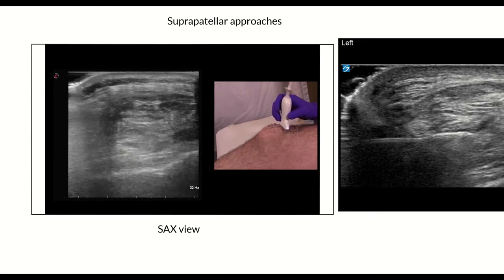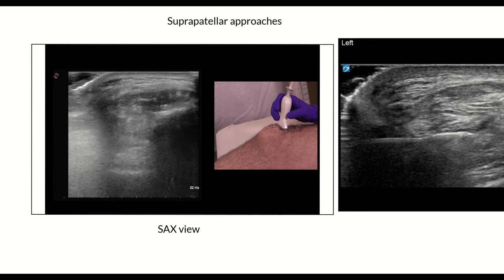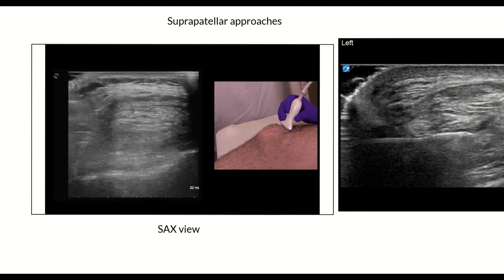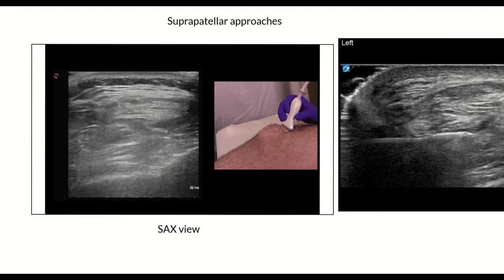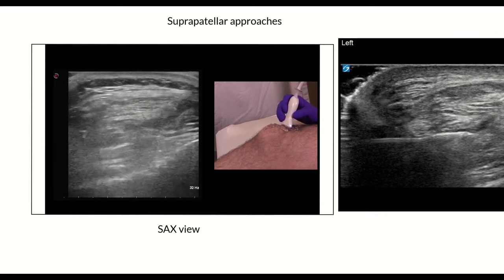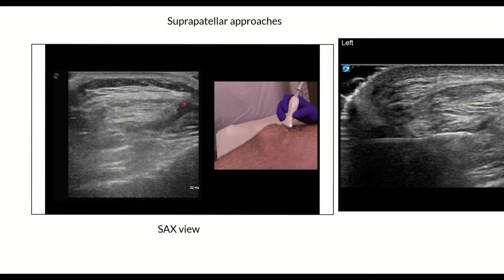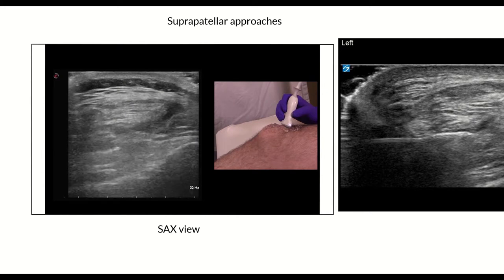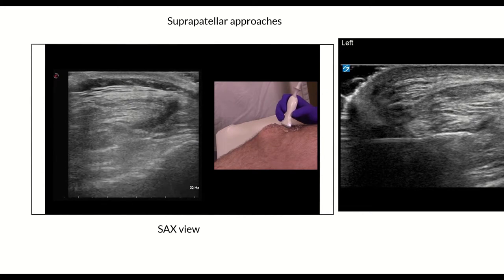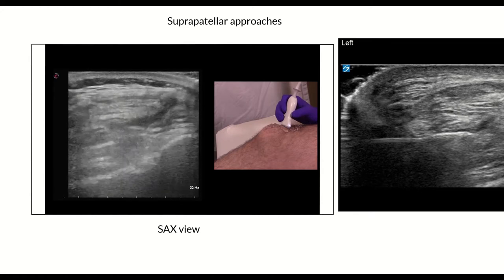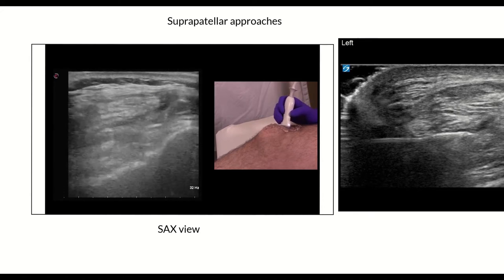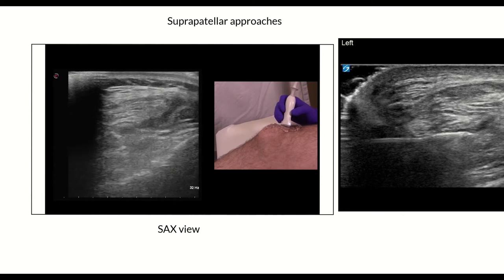Here is some short axis video scanning along the distal thigh, looking at the quadriceps tendon itself and then scanning a little more proximal to look for that synovial fluid line. We can see that the synovial fluid is all along here — this is the quadriceps, and at this level we're only seeing the pre-femoral fat pad. We're compressing the fluid just to confirm that it is actually what we think it is.